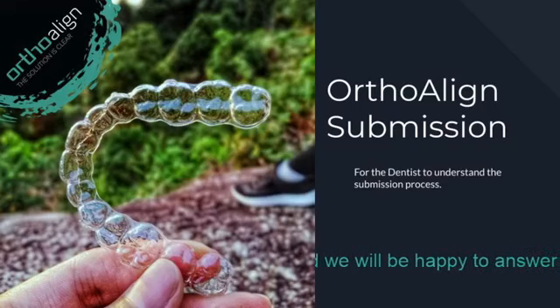Okay, so the next thing that we're going to talk about is the case workflow. What is the workflow of working with our OrthoAlign system? The first thing you would do as a clinician, a dentist or an orthodontist, is your clinical assessment. Okay, so patient selection criteria. Is it going to be a simple case, a medium, intermediate case, or is it going to be an advanced or severe case? You just need to look into the clinical assessment at the very beginning.